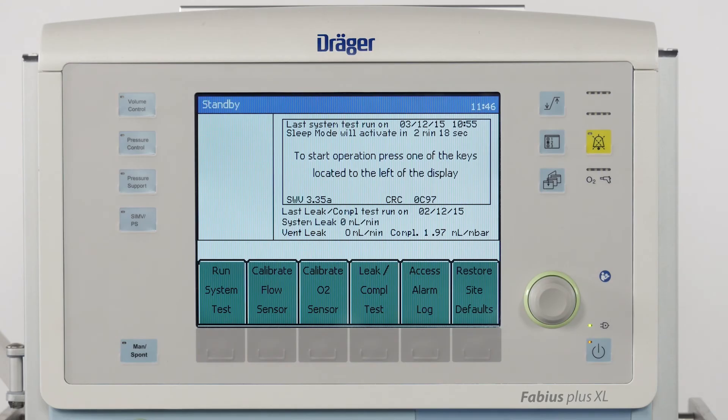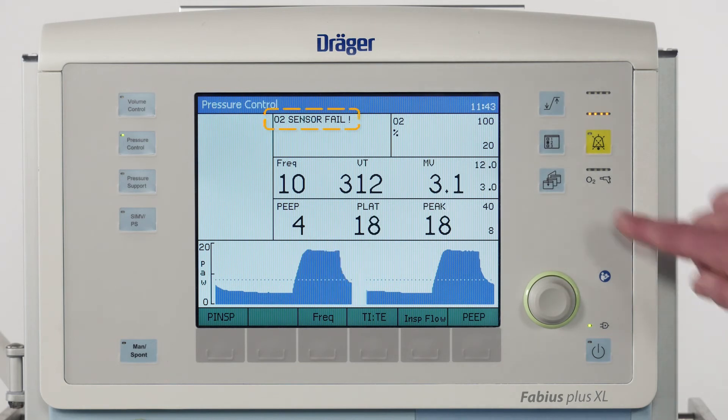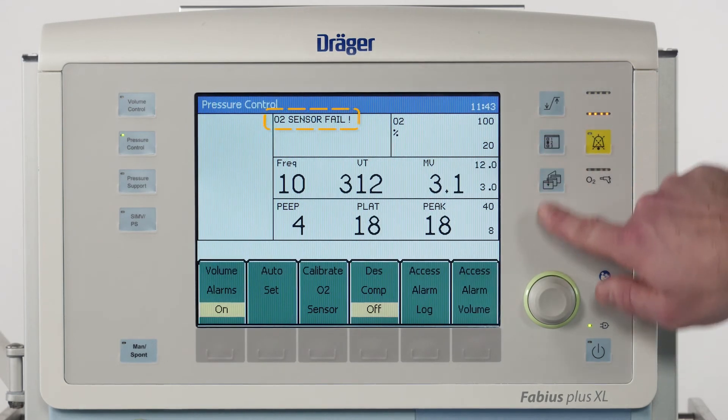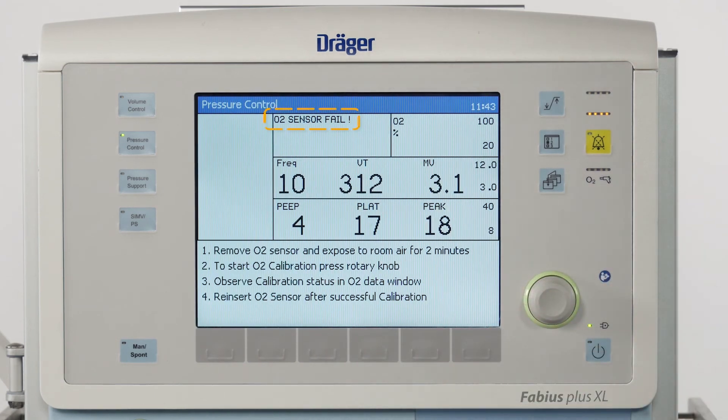As both the compliance leakage test and the flow sensor calibration cannot be done with the patient connected, perform the complete self-test as soon as practicable. If Fabius indicates that the O2 sensor calibration is due, you can do that at any time during operation by pressing Setup and following the instructions on the screen.